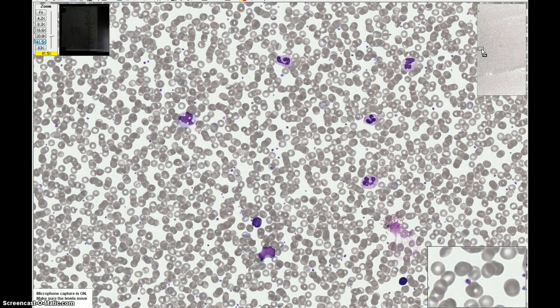At the opposite end of the smear, the cells are too thick. The red cells are overlapped and they stain too darkly.